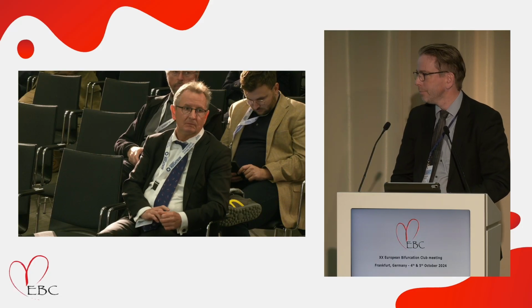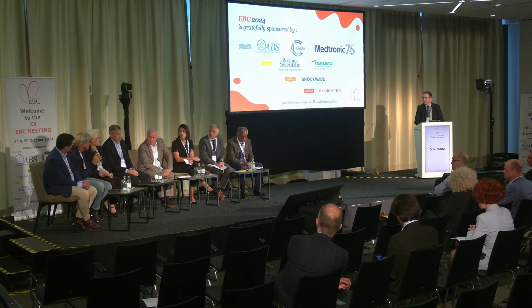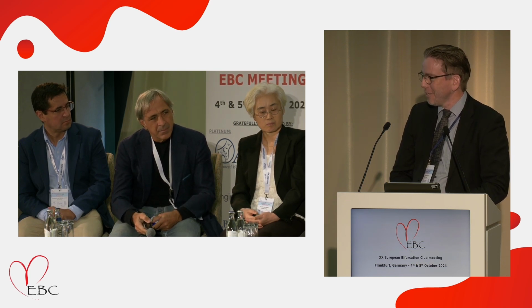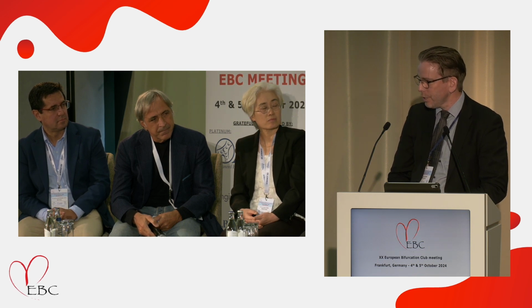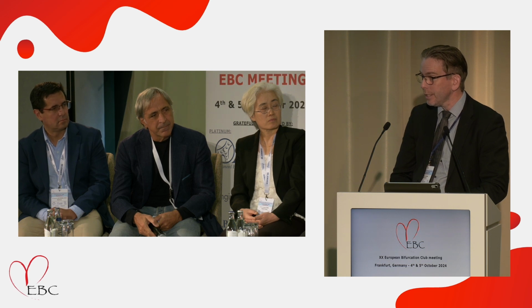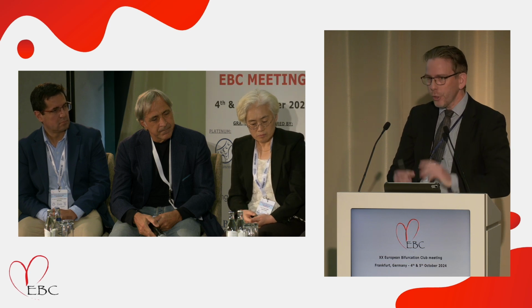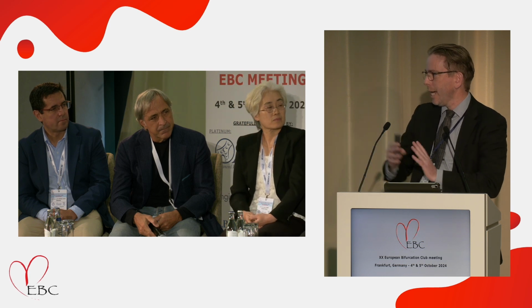Thank you. I have one question. Any impact of the stenting technique in a two-stent approach on the rate of abluminal recrossing? So the most clear relation was the position: the more proximal in the left main, the worse the problem. So it was not really related to whether it was a two-stent technique or a single-stent technique. It was seen with all techniques. We couldn't see that it was much different. But the longer the procedure, the more you had to do, the higher the risk that we had this problem.